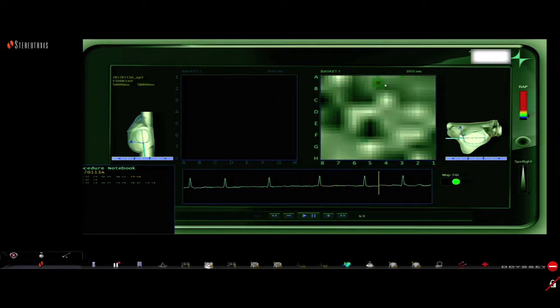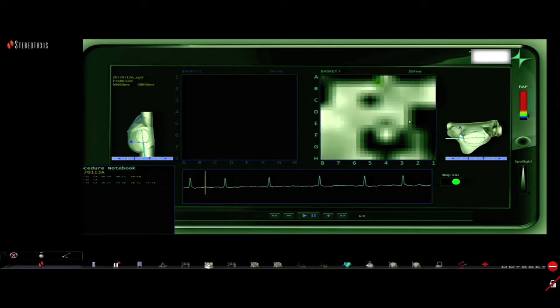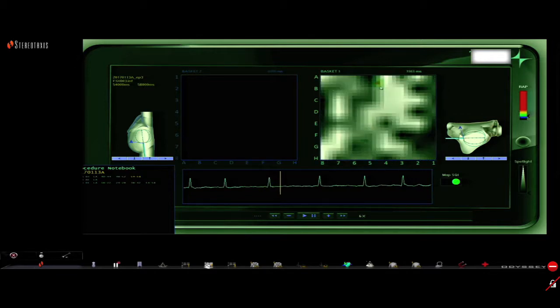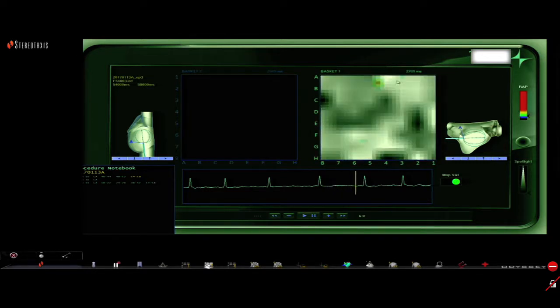Now this is a little stronger area. We still have this area, which is, again, we applied E3, but we're not seeing it as reproducible. But we see something that looks relatively much better up here in AB5.